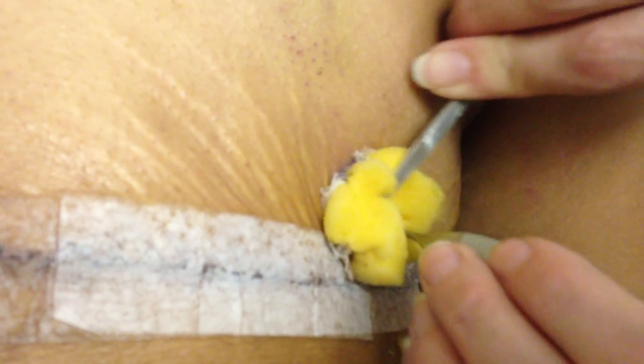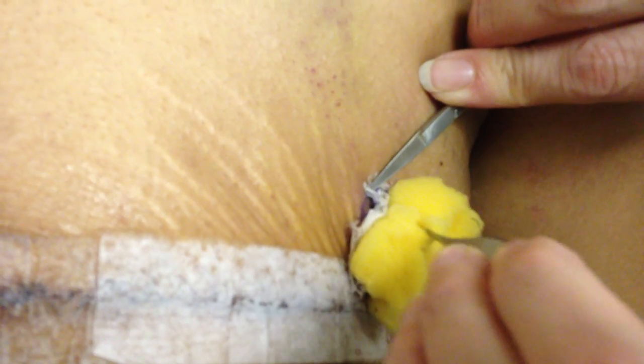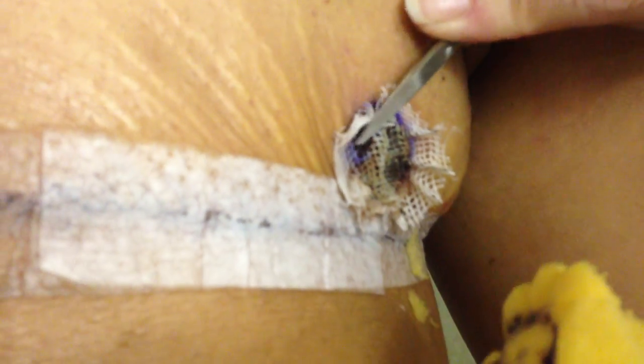Because once I release all those stitches, as you can see the sponge opens right up and there's nothing really holding it on there. So then I hold down that little piece of gel net right at the base and I peel the sponge right off.